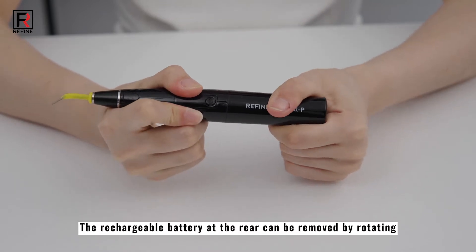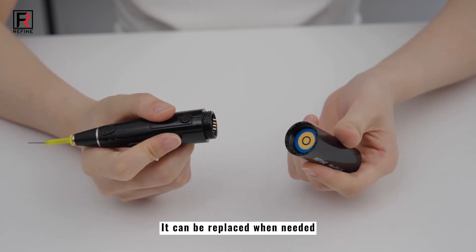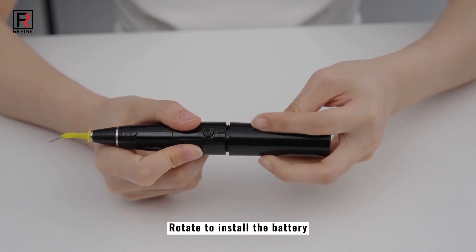The rechargeable battery at the rear can be removed by rotating, and it can be replaced when needed. Rotate to install the battery.